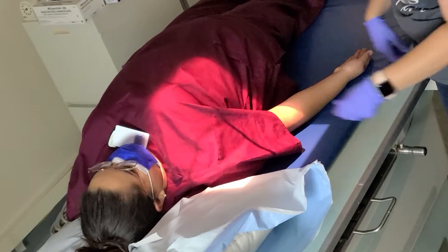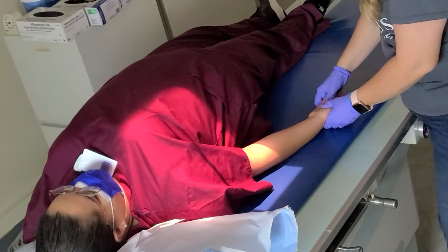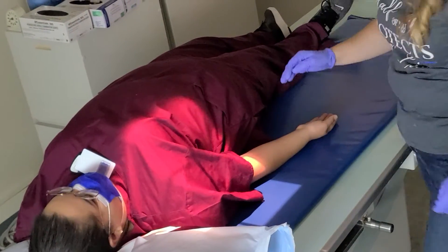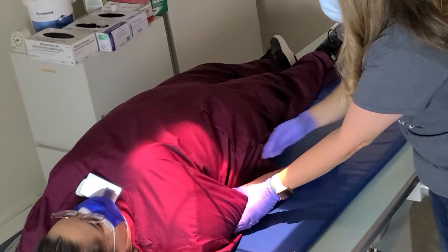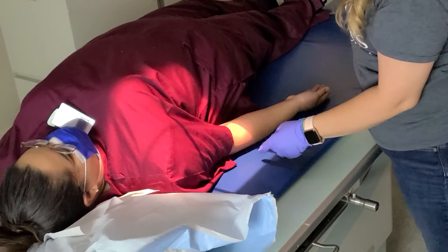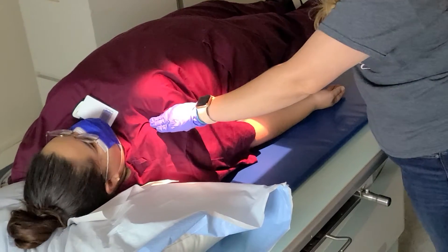Then all you do after that is center mid-humerus. You're going to want some light below that elbow, and about an inch and a half of light above the shoulder — about three fingers. You can have them bend that elbow to confirm you have light below it. Tuck that elbow back in and make sure they're parallel. Center the beam side-to-side at mid-humerus. You can collimate in side to side, but not top to bottom — we want the whole length.